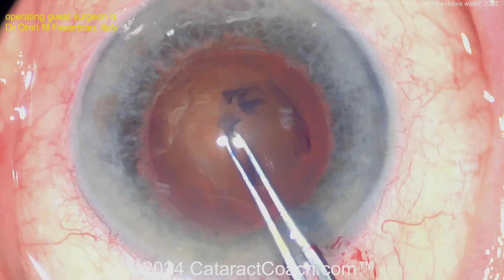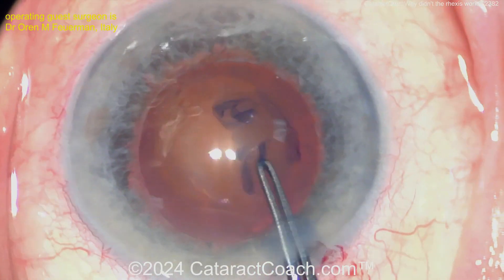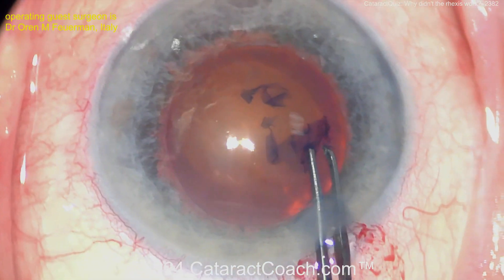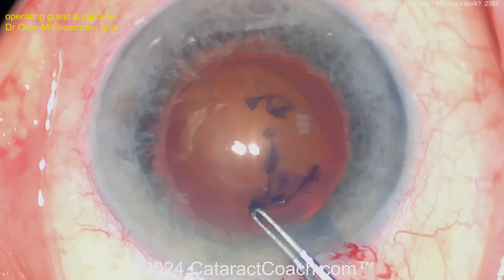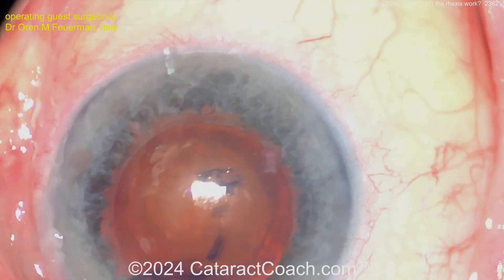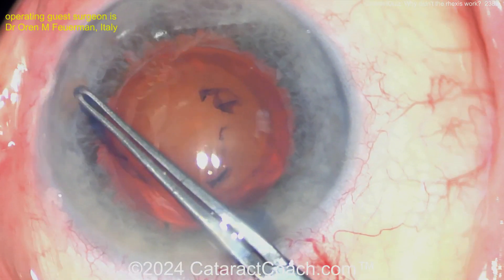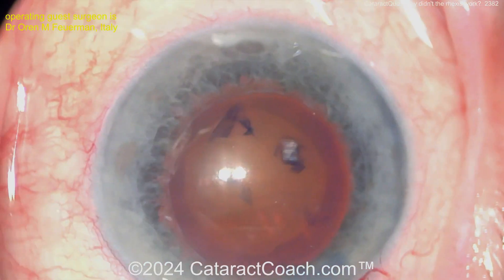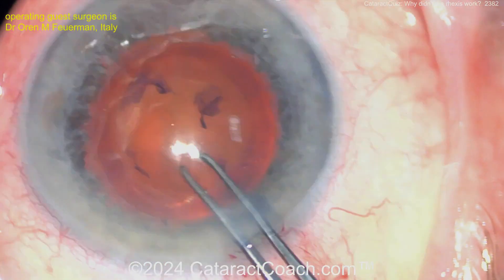Getting that beautifully centered, so it all looks pretty good. Watch carefully because you're going to be surprised. Have you figured out what's going on yet? It seems like a thin capsule, but look — that's a beautifully round circle, a nice clean capsulorrhexis. Looks great. Ready for phaco?